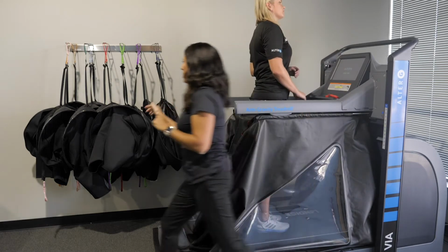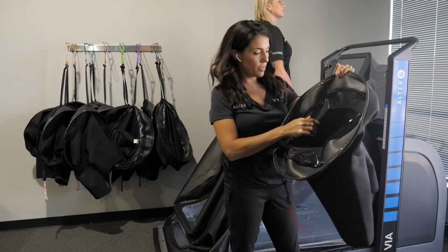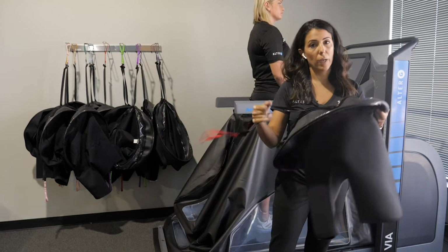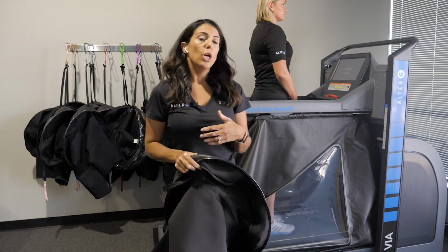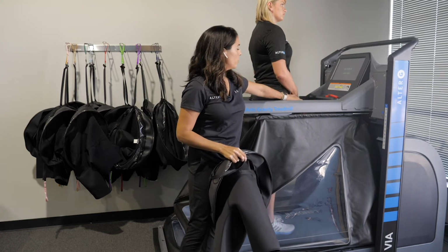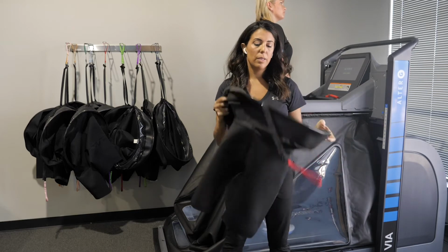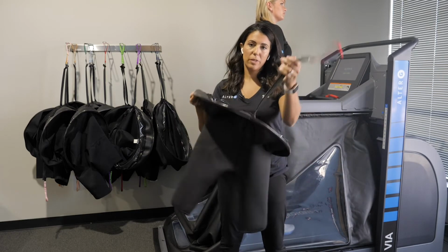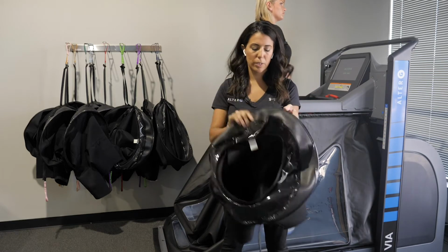So really quickly, I want to show you one thing with the shorts as well. Some of these shorts you can see have 2 zippers, and some of them have only 1. This allows us to zip into the machine in a variety of ways. The shorts that Katie has on now have 2 zippers, versus this pair in my hand, which has 1. If I wanted to zip into the machine forward, I simply put the zipper in the front and the tag in the back, like a traditional donning of the shorts.